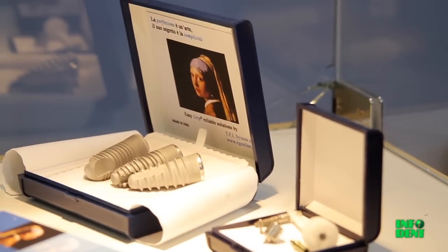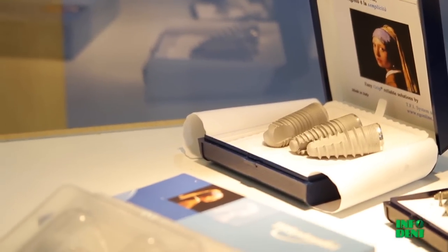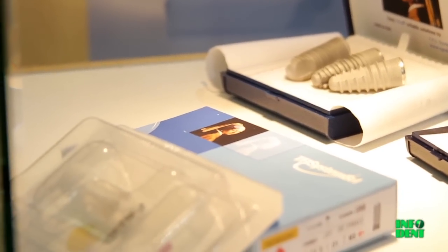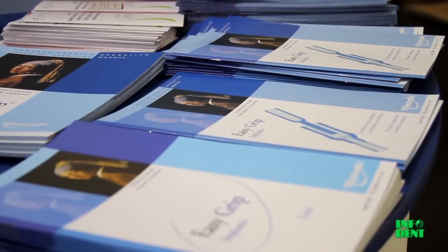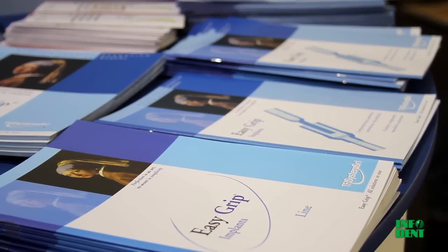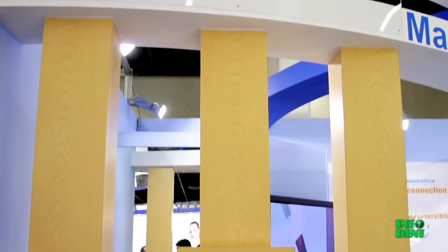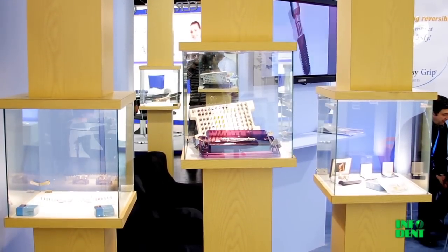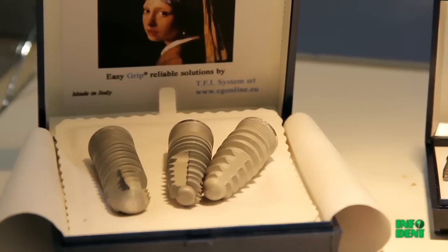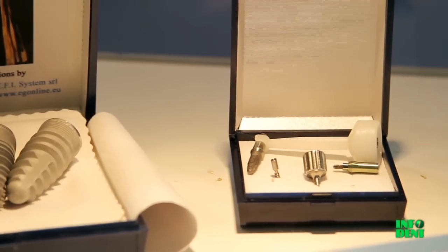Our constant research for simple and innovative implant solutions has currently brought the development of a new connection system called Monoblock. The uniqueness and distinction of this system, which for these reasons has received a commercial patent, is the creation of a fixture abutment connection made without using either screws or Morse cones, but simply with a pin coupling, making this connection reliable and completely reversible.